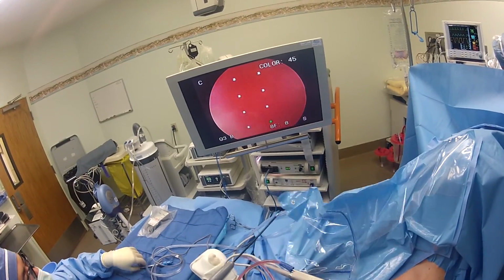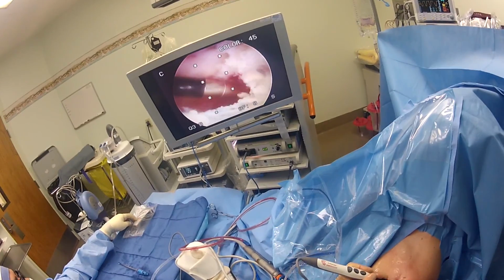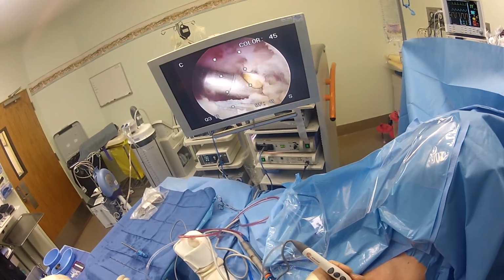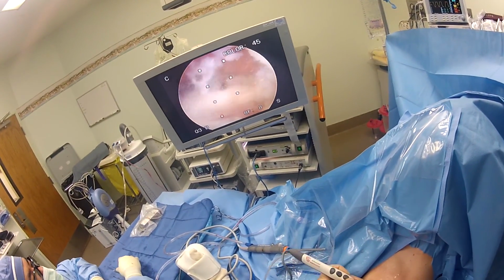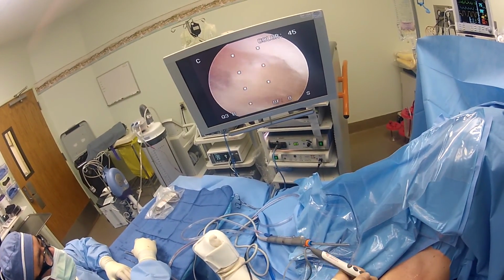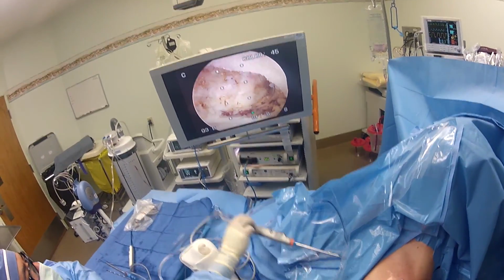And then, you heard me call it before, poo corner. It always bleeds. It helps if you get your triangulation skills down. Sometimes it'll bleed so much that you really got to go by feel because you can't see. That's what's nice about these Arthrocare units. You can kind of do Bovie by proxy, I call it. Just get it in the area. And you can just see there's nothing that makes it even look like an AC joint.